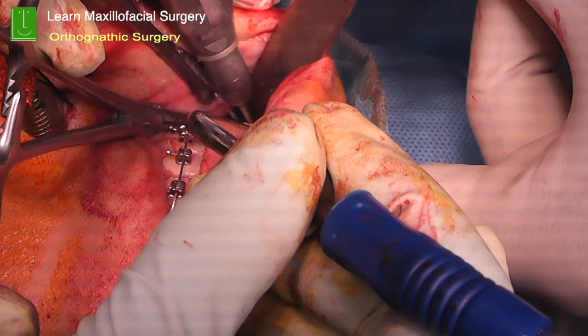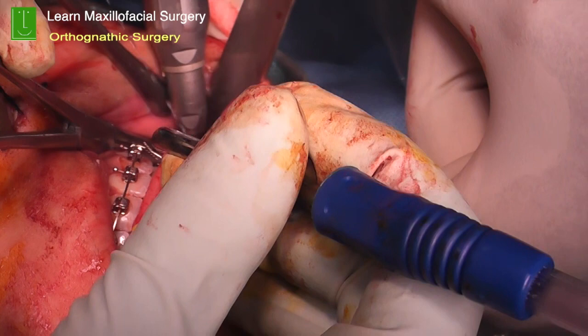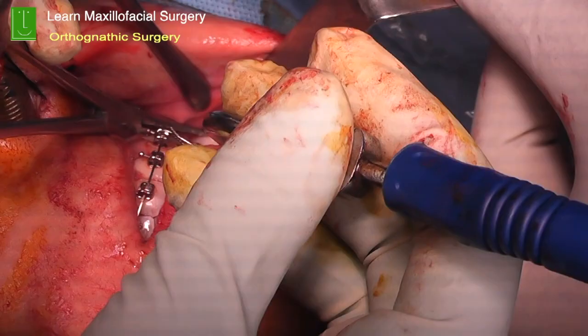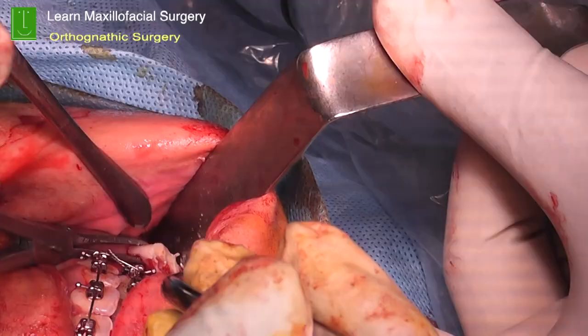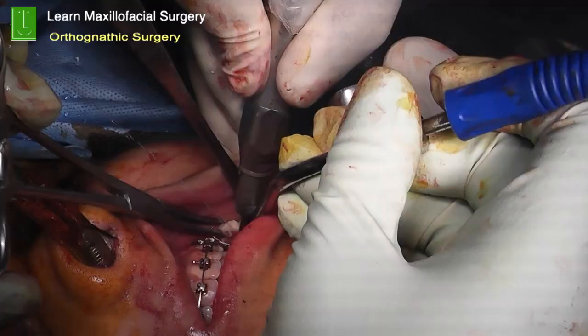The excess bone, once you set back the mandible, there is going to be always a bit of excess bone in the ramus of the mandible. That needs to be removed. So very carefully, without damaging the nerve, it is important that you take it out. So you usually take out 5 or 6 millimeters, whatever the planned procedure. In this case, we have taken out 6 millimeters of bone on one side, and the other side we have taken out another 7 millimeters.